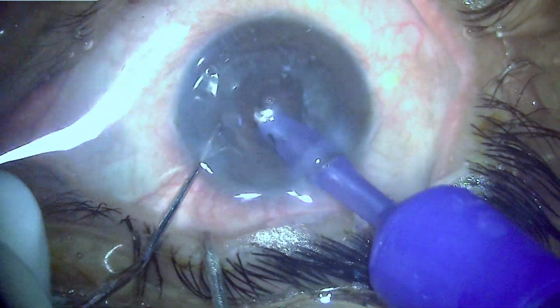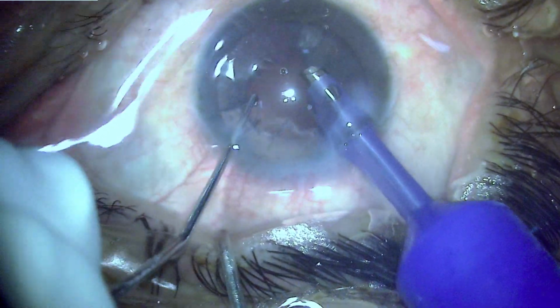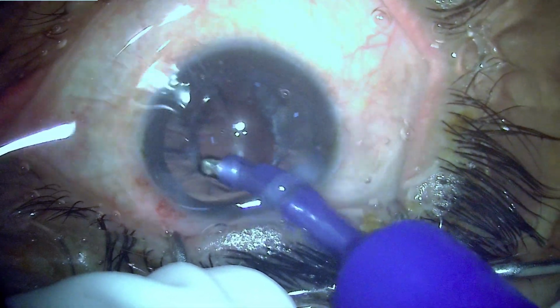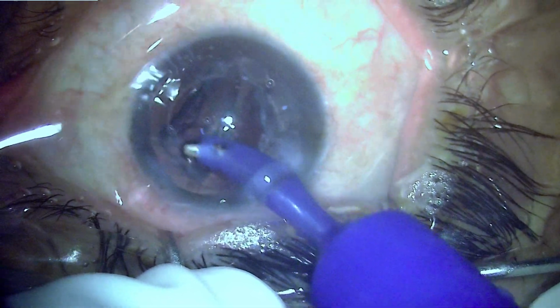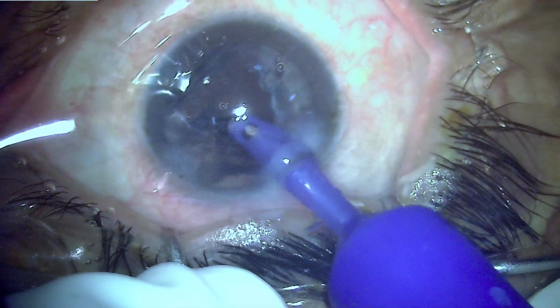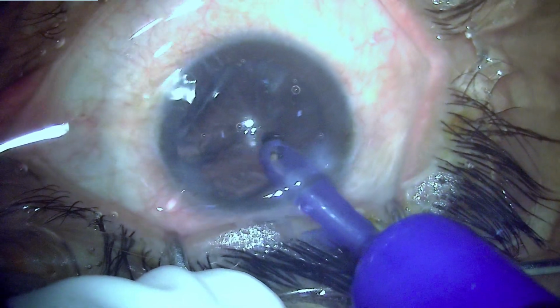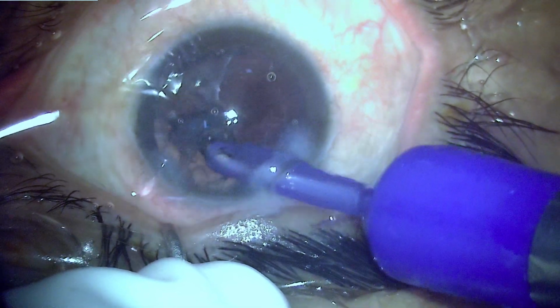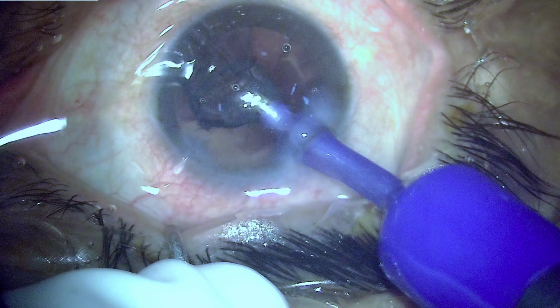Nucleus has been removed, removing the epinucleus, and now going for the cortical removal plus some epinucleus which has been left behind. Myopic patients will always have that risk of deep AC, a thin capsule, and a risk for posterior capsular tear. So one should be vigilant and also take care that appropriate tool is used. So using an IA cannula is much safer compared to the phaco tip to remove the cortex and epinucleus.